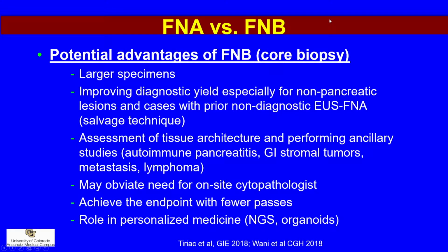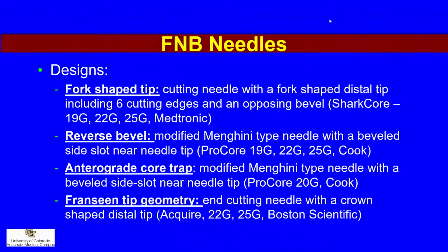We are routinely using FNB needles, not because I feel that these are superior to FNA needles, but because all our oncologic-related trials and protocols require us to use FNB needles for specimen collection.